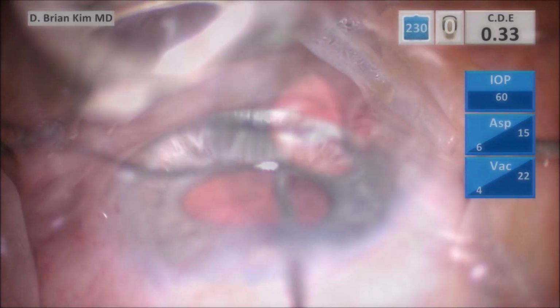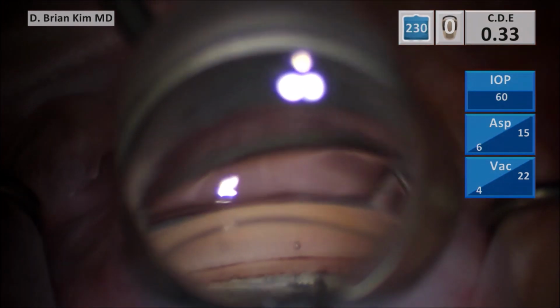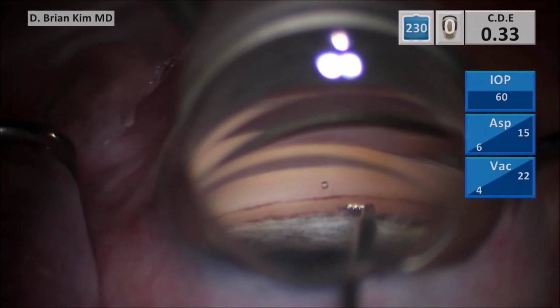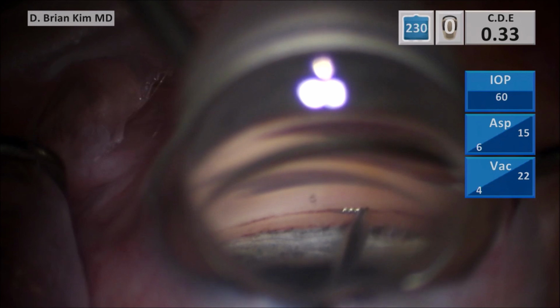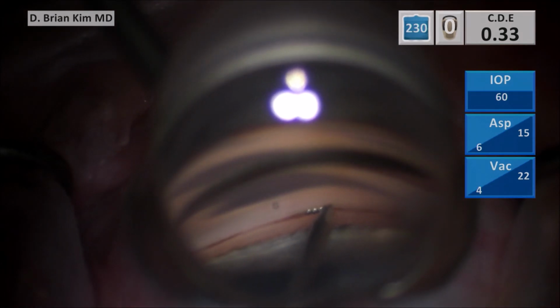And in this case, I have an iStent, so as I come out with the I/A handpiece, I push BSS, and then I inject the eye with some more dispersive viscoelastic. I want to turn the head very far away from me and rotate the microscope in such a way that it allows me to get a better view of the angle.